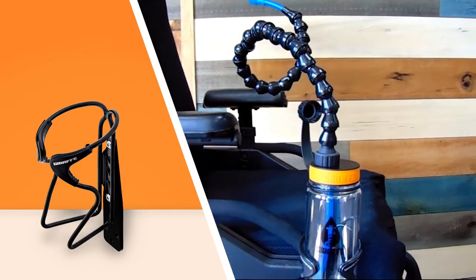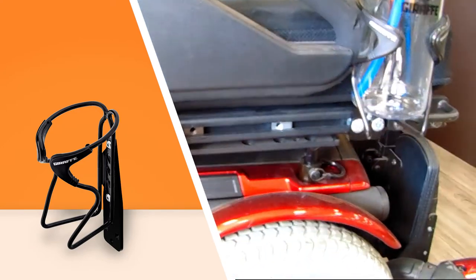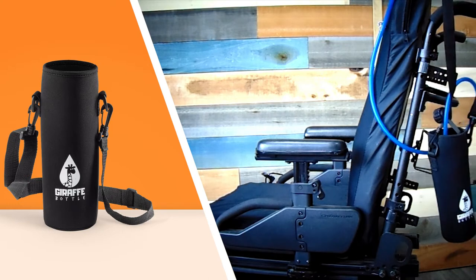We've also got a bottle holder with a universal rail bracket. Individuals using a Quantum or Permobil-type power chair can mount the accessory to the chair easily, thanks to the included hardware.